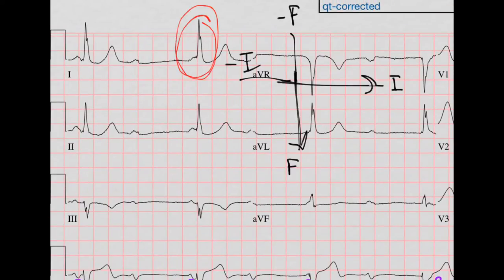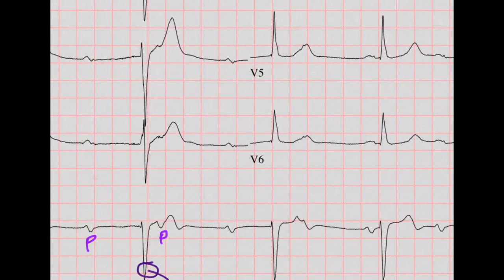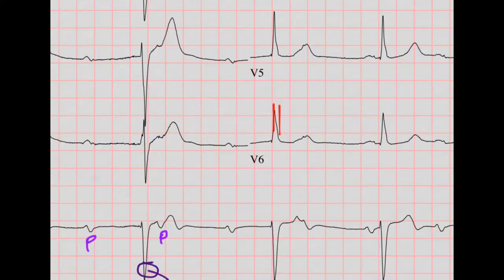So we call that a complete heart block — third degree AV block. Now let's move to axis. Lead 1 is definitely mostly positive, and F is also mostly positive, so we're in this quadrant — normal axis. Let's do our intervals. You can't really do the PR interval because the P and the QRS are not related, so we'll skip that. The QRS looks pretty narrow — about two small boxes — so we'll say normal QRS.